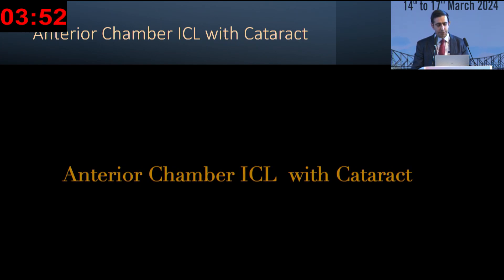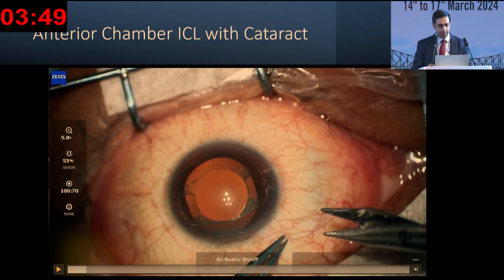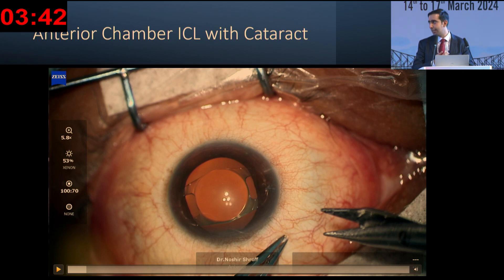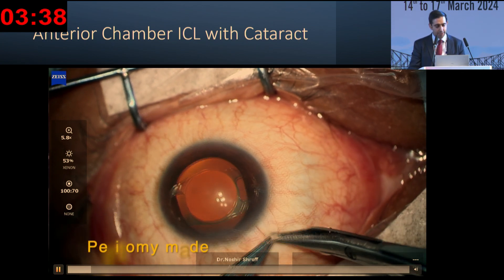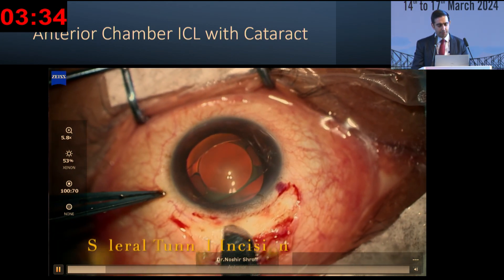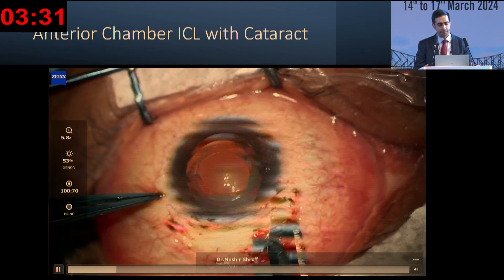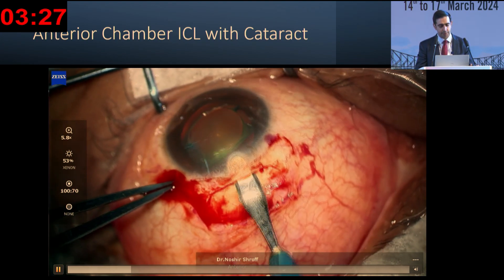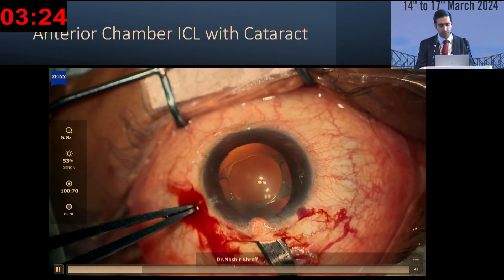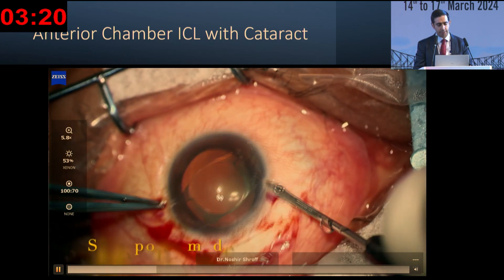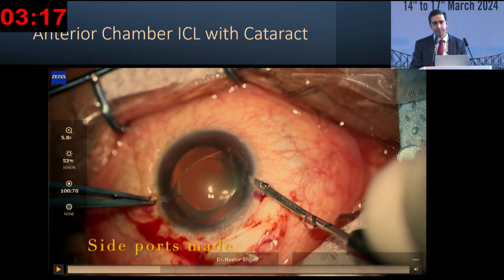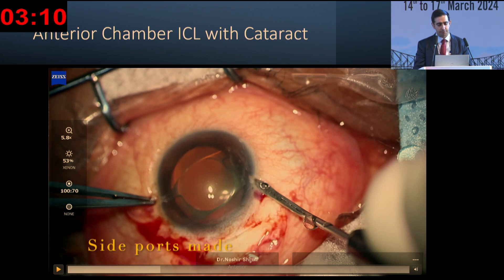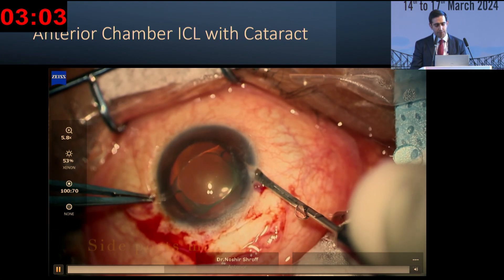The next is a strange case — I haven't seen this before. This is an ICL actually placed in the anterior chamber, and now this patient has developed a cataract. I made a scleral tunnel because this kind of ICL is made of PMMA, so I couldn't cut it in the anterior chamber — it would cause more damage to the endothelium. The side ports, because we have to disenclave those haptics, are being made tangential along the limbus rather than perpendicular, so the instrument to disenclave can be introduced more easily.